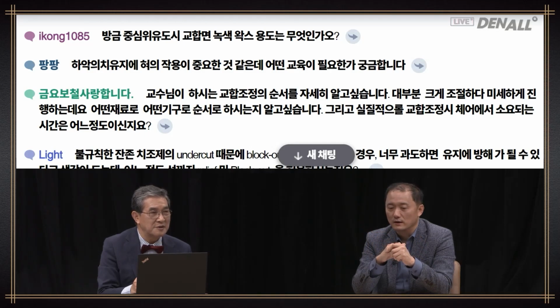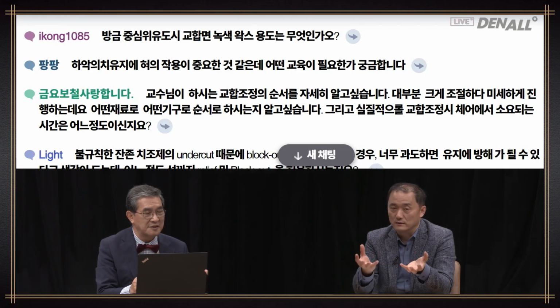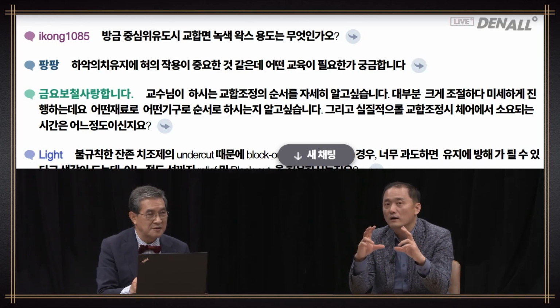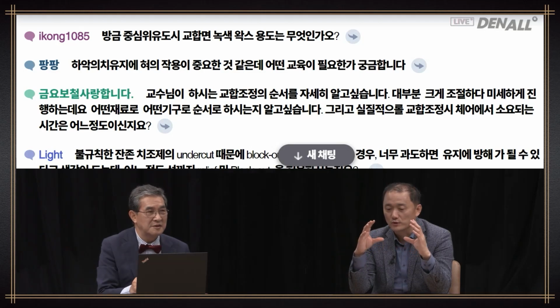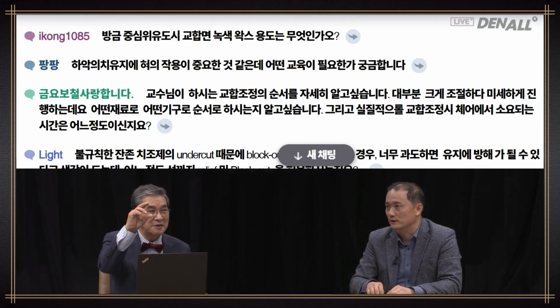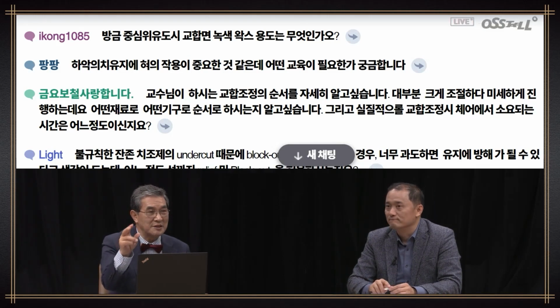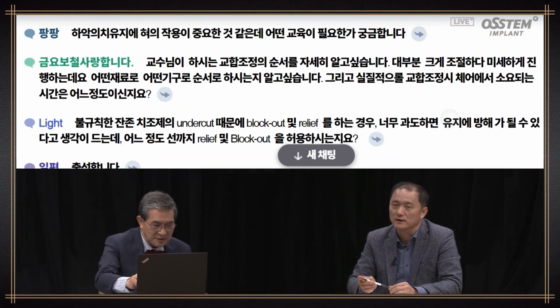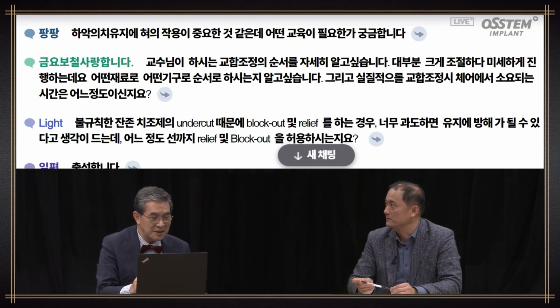It's happening together? No. Probably because of the elasticity of the soft tissue, there are premature contacts that you might not have thought of. So you have to be aware of that and secure a good relationship. In other words, when you take the jaw relationship, you load simultaneously on both sides using wax. So in guiding centric relation, there is simultaneous mucosal loading.